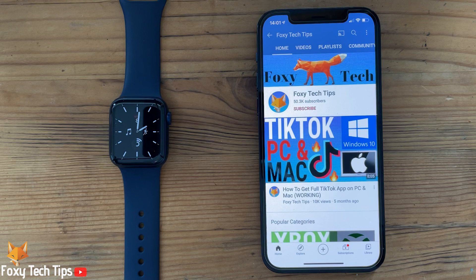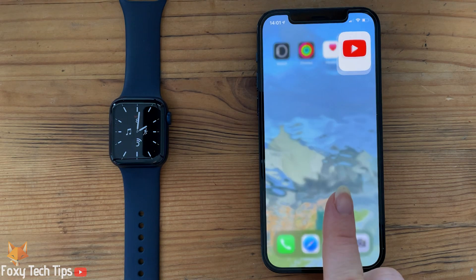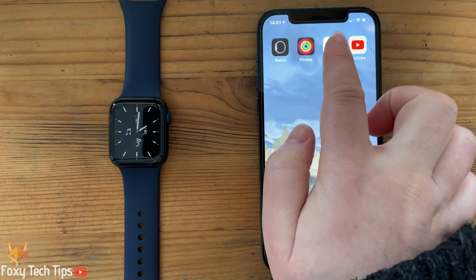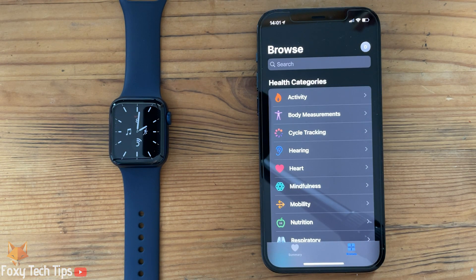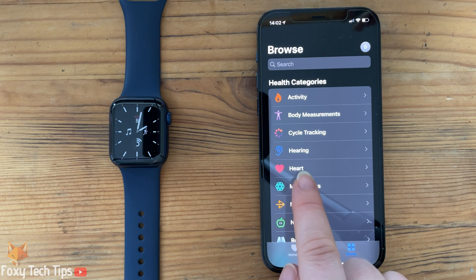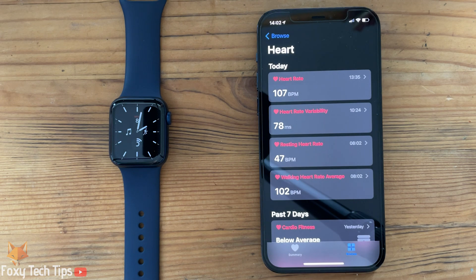The first time you want to use the ECG feature, you will first need to set it up on your iPhone. On your iPhone, open up the Health app, tap Browse, select Heart, and tap Electrocardiogram.